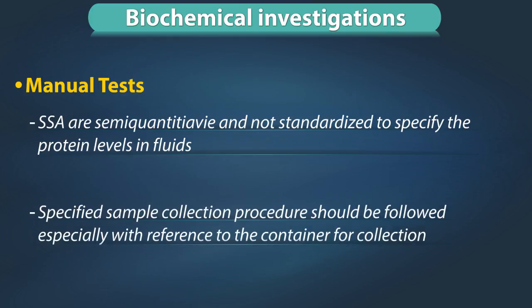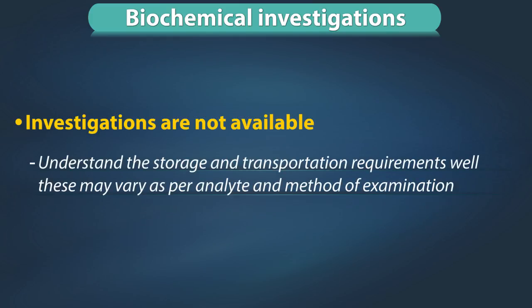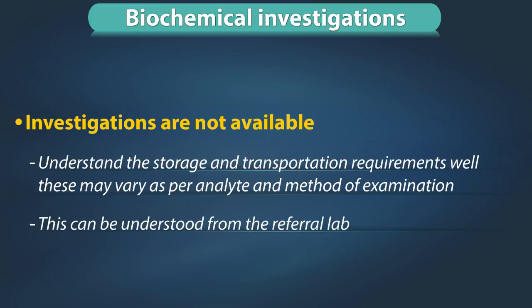Also, the specified sample collection procedure should be followed, especially with reference to the container for collection. If the investigations are not available in your lab, you must understand the storage and transportation requirements well. These may vary as per analyte and method of examination. This can be understood from the referral lab.